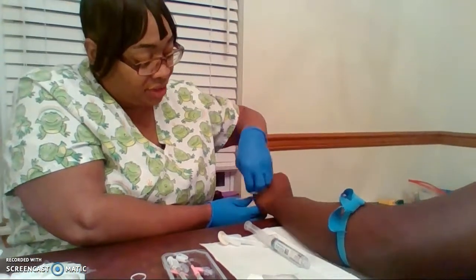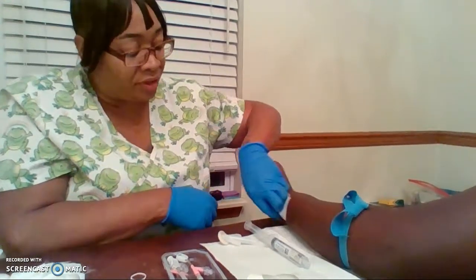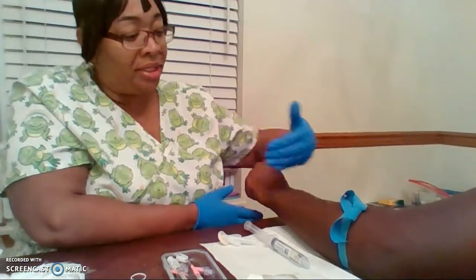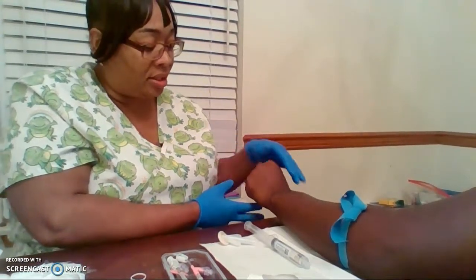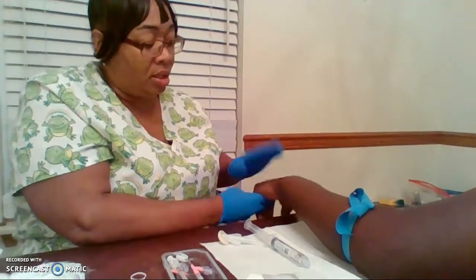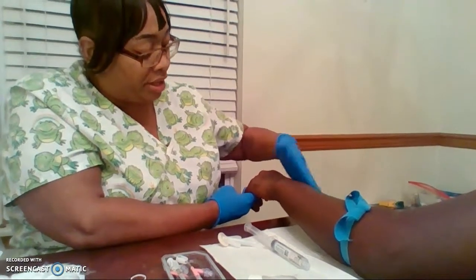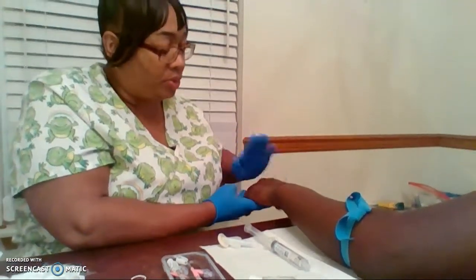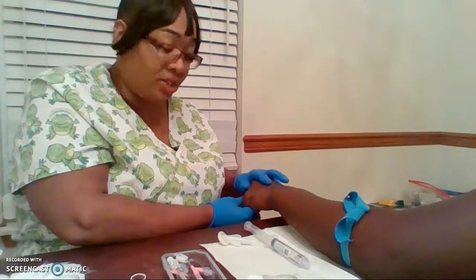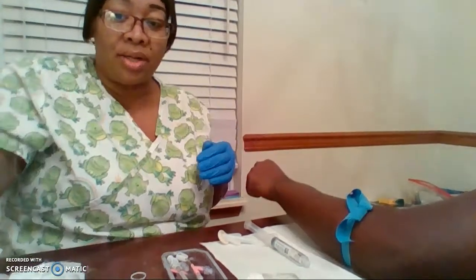Cleansing it with the CHG, having the patient pump their fist while the tourniquet is in place allows the blood to flow down to the hand, but then it will backflow into the veins that we are looking at for this particular IV. Patting the veins in the intended areas that you've selected will help to puff the veins up to make them more spongy to your touch. Keep pumping for me, sir.